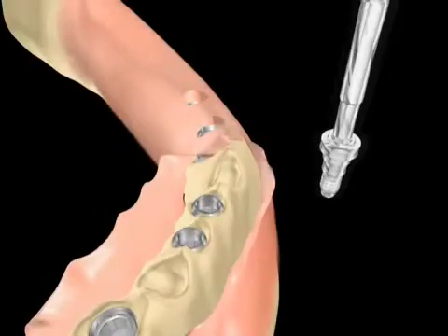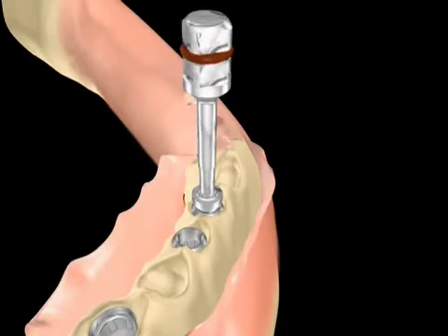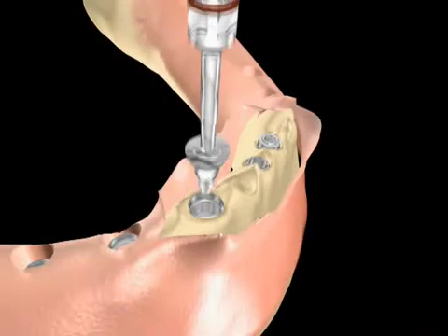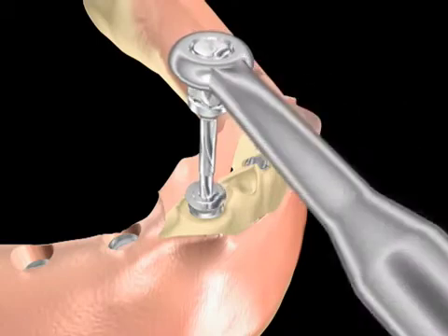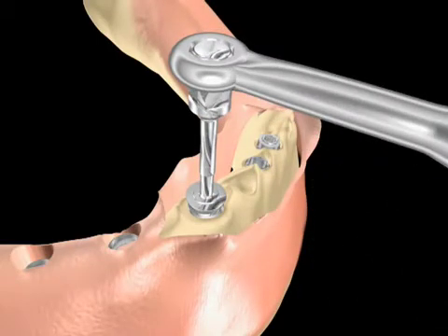Upon placement of the implants, the appropriate Flat-1 abutments are secured. These abutments are available in two platforms: a 3.5 mm narrow platform and a 5 mm wide platform. In addition, they are available in three different heights, ranging from 1 to 3 mm, thus enabling the ideal placement of each abutment and optimum margination of the final restorations.